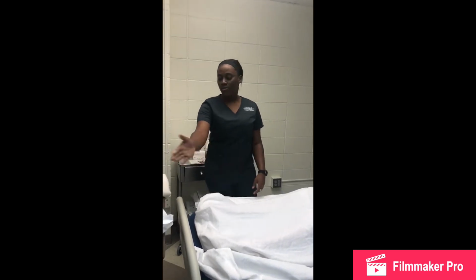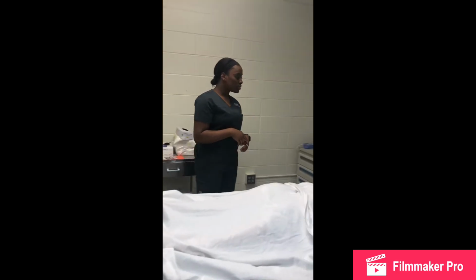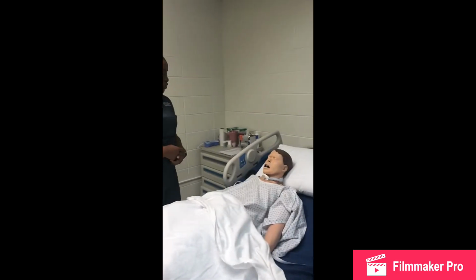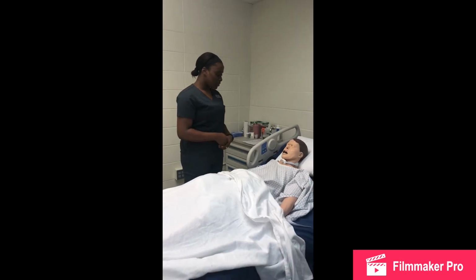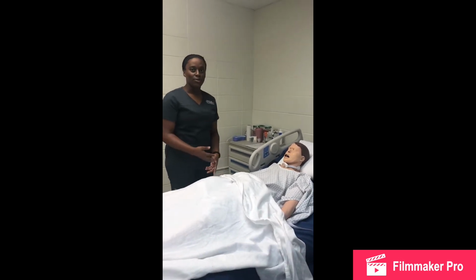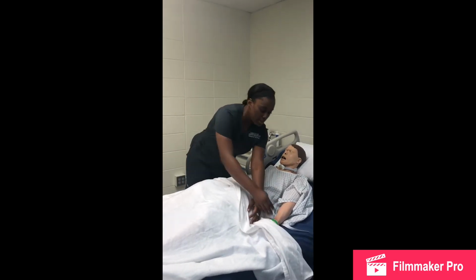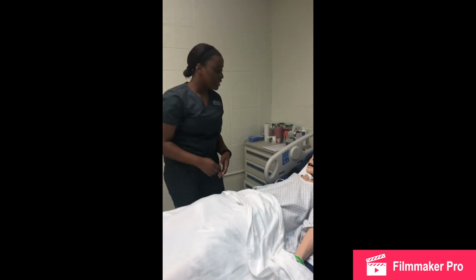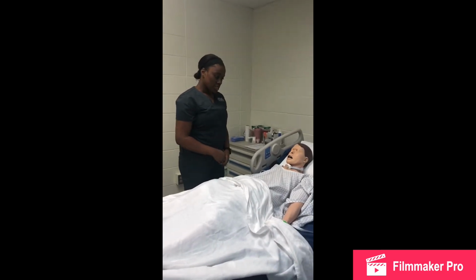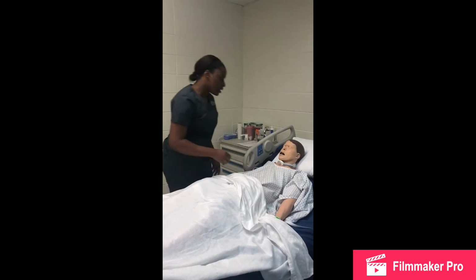Right? So now that I've got all my supplies that I'll need for this procedure, I'll go in my patient's room, introduce myself. Hi, my name is Ushin Walker, and I'm a nursing student. Can you please tell me your name and date of birth? I'll make sure my patient verbalizes this information with me. So my patient name is Egbert Livingston, okay? His name is Egbert Livingston.